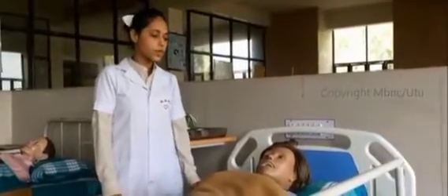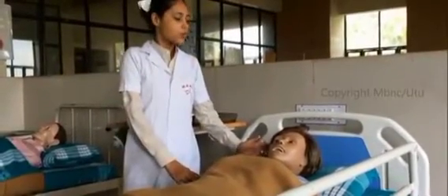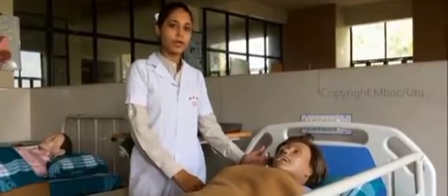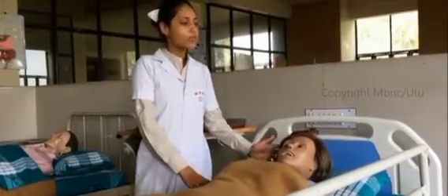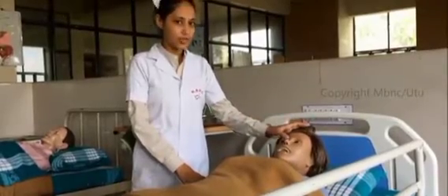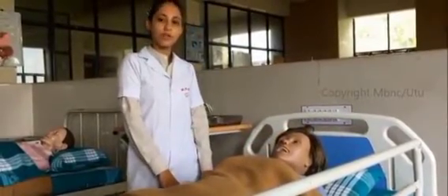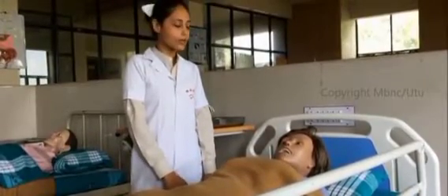Now we are going to see the procedure of NG tube insertion. First is the preparation of the patient. If the patient is conscious, we have to explain the procedure to the patient. If the patient is unconscious, we have to explain the procedure to the family member. After the explanation, we have to check that the assessment and history collection have been done. Again, we have to check whether a nasal septal deviation is there or not before insertion, and whether there is an issue of nose bleeding. Then we have to give the patient a comfortable position. Here we will give the semi-Fowler's position to the patient before inserting the NG tube.